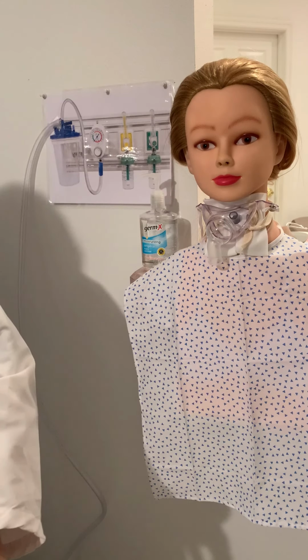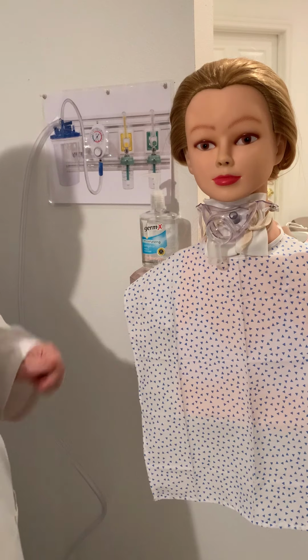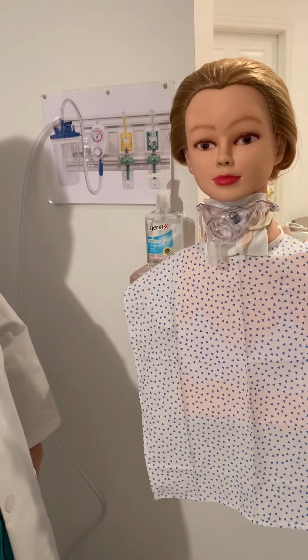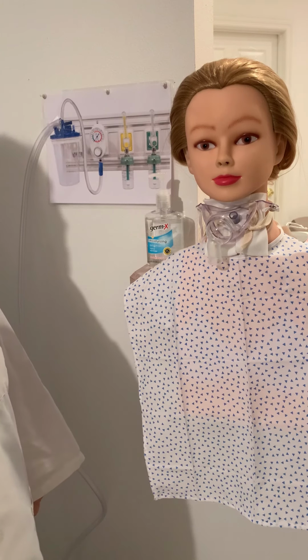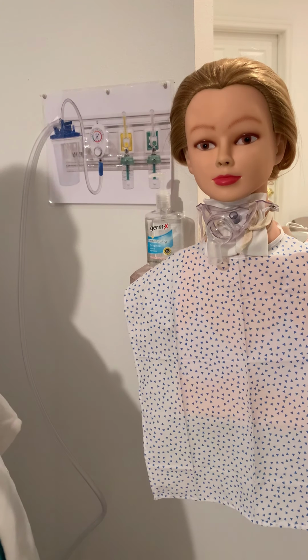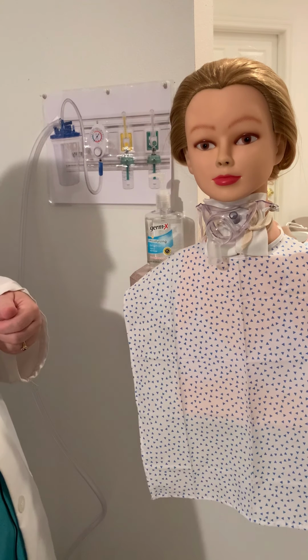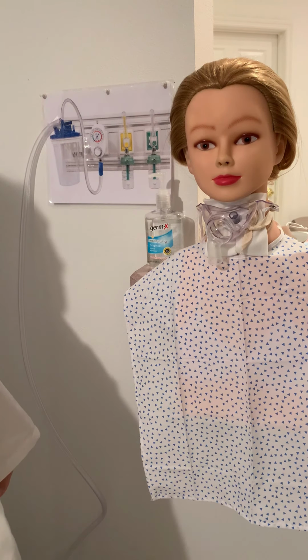So once we have our supplies ready, we will go to the patient's room. We're going to wash our hands. We're going to knock on the door. Hi, this is Linda, your nurse. I am just coming in to check on you and see how you're doing. Can you please verify your first and last name and date of birth for me? And I would check the armband and the medical record and make sure it matches. And I see that it matches.